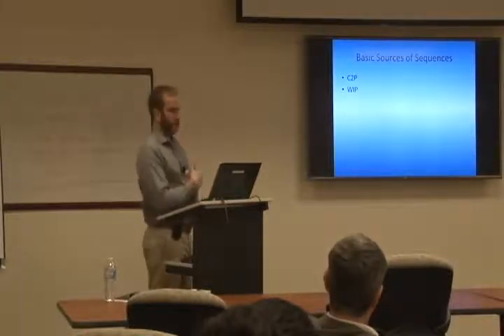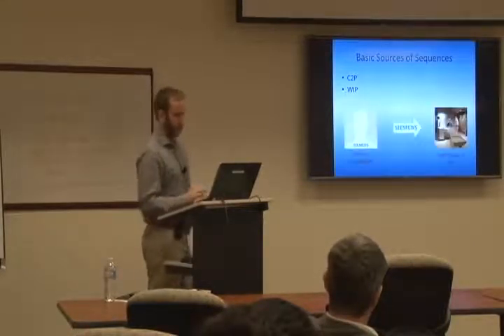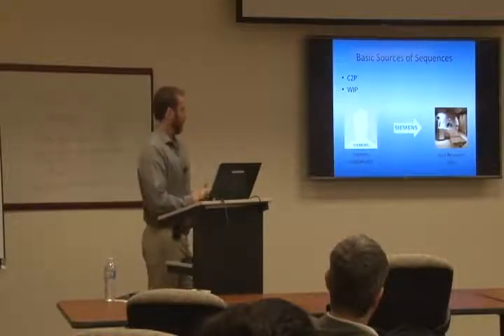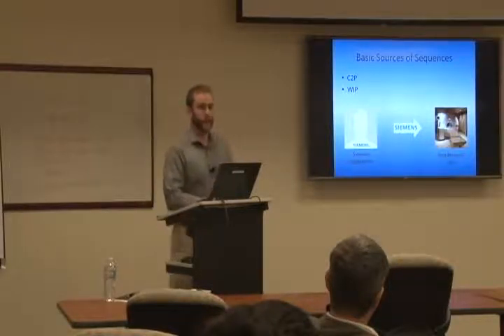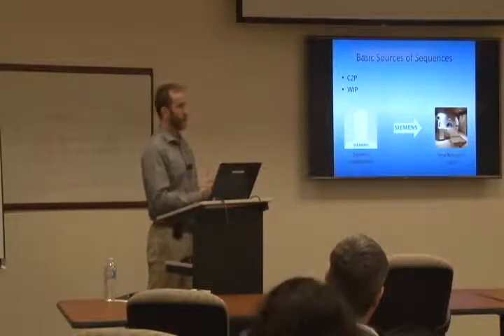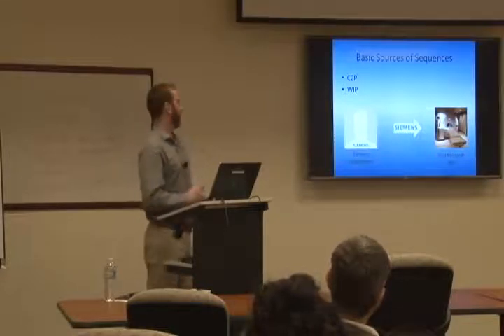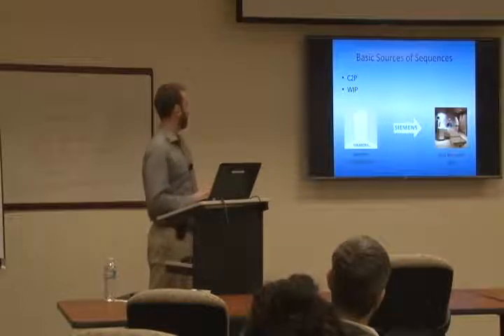Another way is a WIP, a work in progress package. That's where we have the Siemens programmer. It's on its way to becoming a Siemens product, but they want people to be using it. So it may seem like it's in Siemens development, so you've got to jump through a bunch of hoops to get it. But really, they're eager to have people working on it. They want feedback from different sites that are doing it, and these are going to be cutting edge sequences that you can get access to just with an email away.